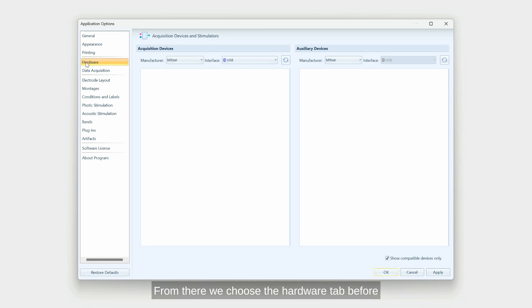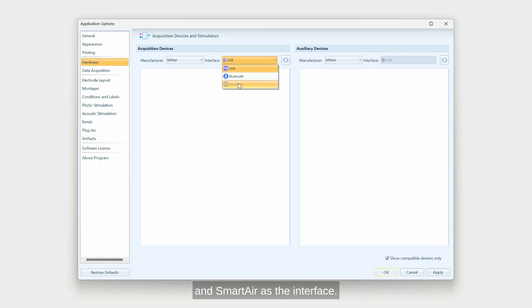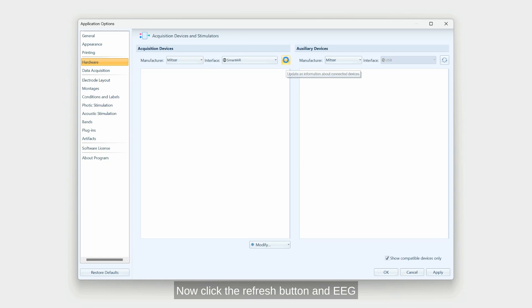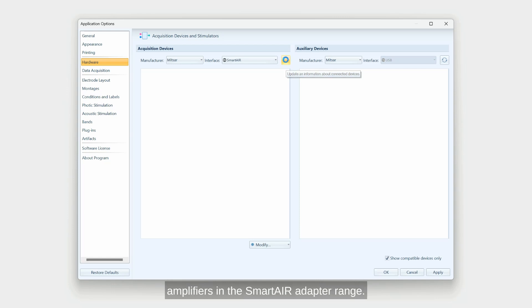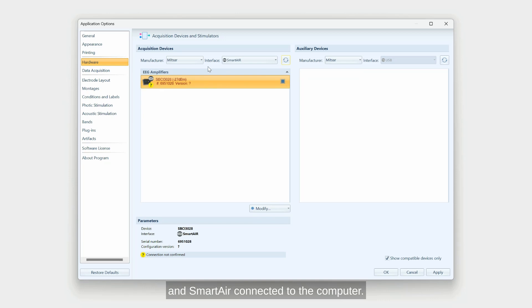Before detecting SmartBCI amplifier, we need to ensure that Mitsar is selected as the manufacturer and SmartAir as the interface. Now click the refresh button and EEG Studio will look for all SmartBCI amplifiers in the SmartAir adapter range. Remember that SmartBCI needs to be on and SmartAir connected to the computer.